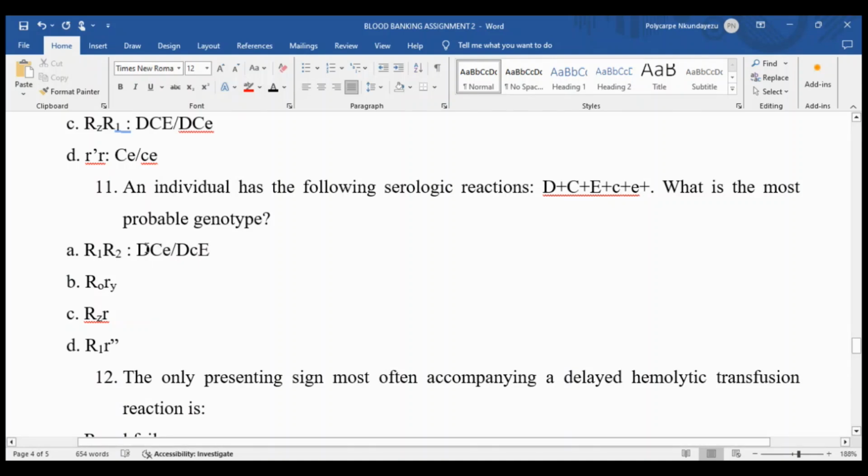Okay. All antigens are there. So we have D, we have C, we have capital E, we have small c, we have small e. All of them are present. So they can type as positive in this way. But let's try to consider this one. Let me see if this one cannot. This one, for example, it can't, because you can see we don't have which antigen? Do you have all antigens here? We also have all antigens. How can we type? It is typing for all.